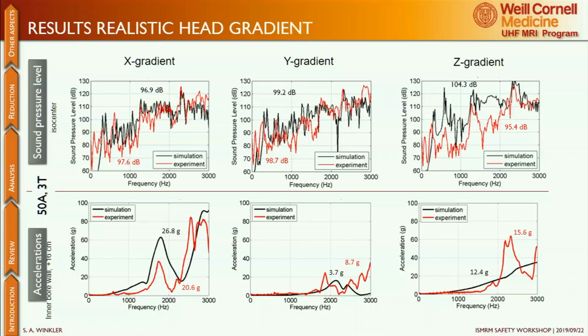So they're fairly similar. So now I know in 2 presentations ago we saw something different. So I think there are some open questions, but at least it's food for thought. Then one more observation here is that there's a coupled resonance, and that one does not really observe the linearity here.